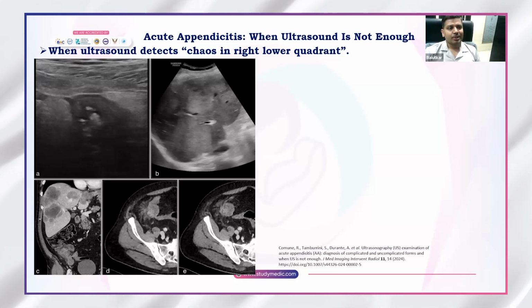So now they need to rule out the neoplastic etiology, and in this particular case it was because of the malignancy of appendix, which has metastasized to the liver parenchyma. Okay, so though it is very rare, neoplastic involvement of the appendix always needs to be considered while doing ultrasound examination for acute appendicitis and for right iliac fossa pain.